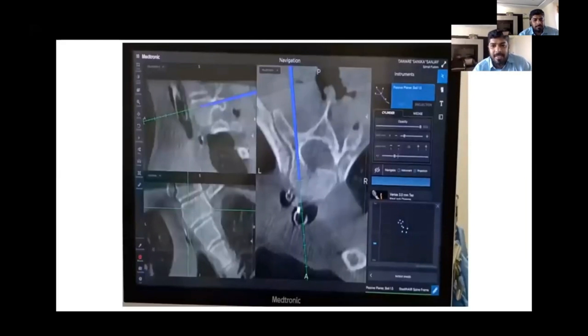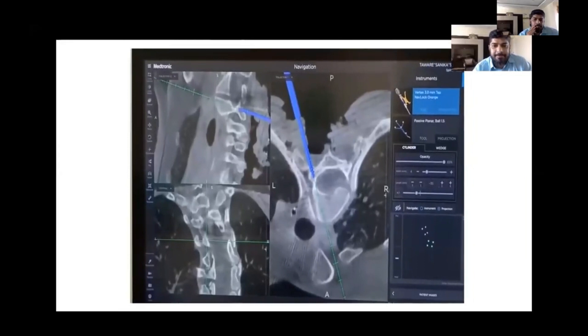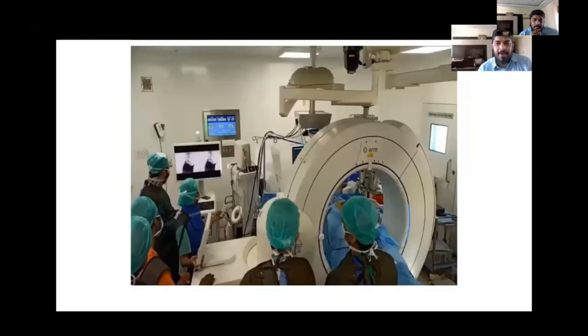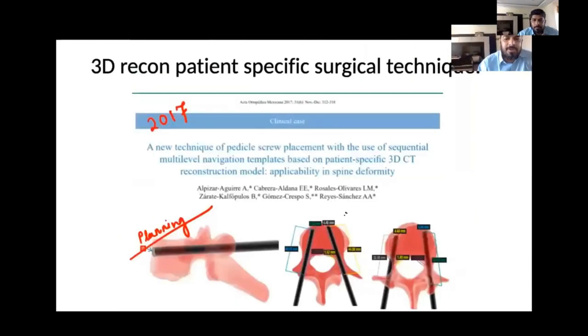We achieved very good correction, around 70-80% with good vertebral screw density and excellent deformity correction. O-arm always helps. In deformed pedicles, we can go very slow and carefully. This is the pedicle of the apical concavity in the thoracic spine, and nowadays with O-arm navigation we can be very precise. These patients are very, very happy with good correction.